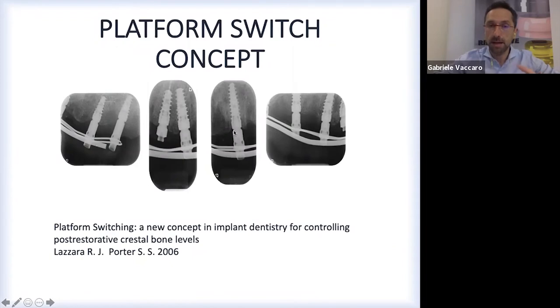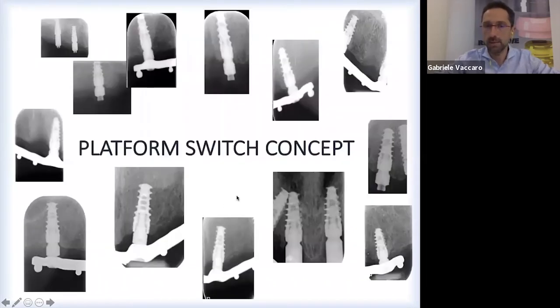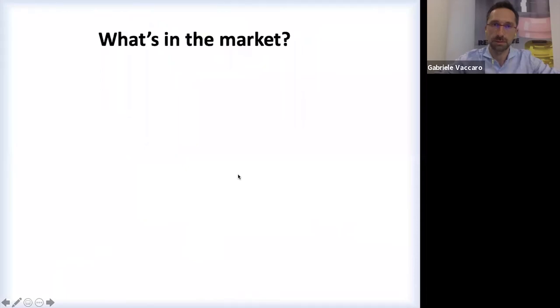But watch out that you don't have to remove this anymore after the first placement of the implant. Try to imagine what would happen if I start to take away this abutment, take the impression, then screw again this abutment, and then unscrew again and mess around. What would happen to this? It would disappear immediately, very soon.